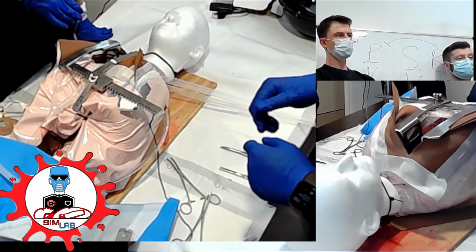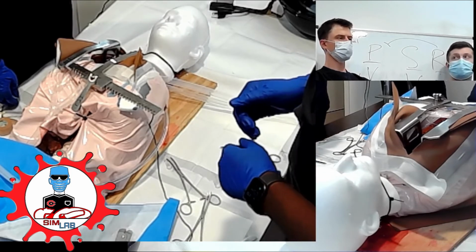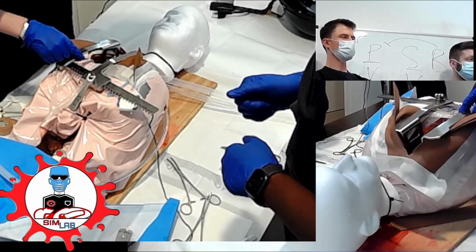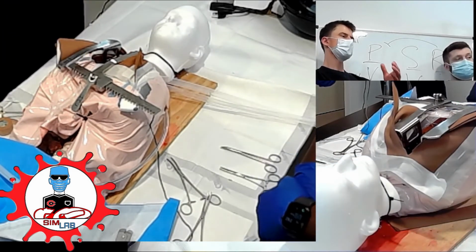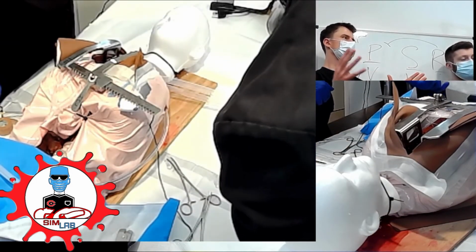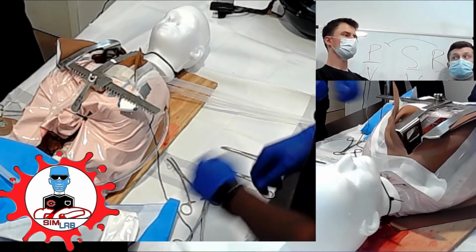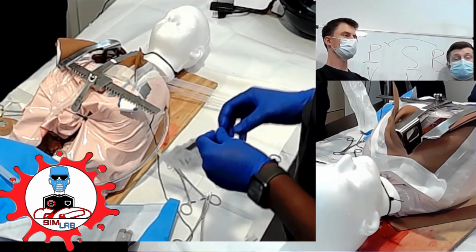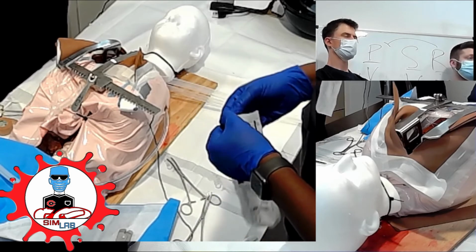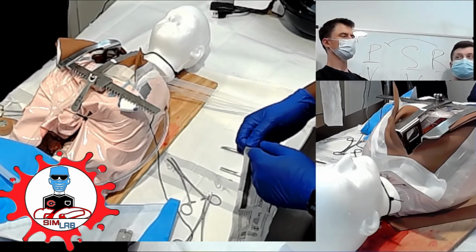But aortic stuff, I got trauma with me, right? Everything else, you can probably pop open, alleviate a little bit of pressure without fully opening the heart, and probably still be okay. If this is really just tamponade, just opening that sternum, maybe just doing that alleviates it, and then you have a perfusing rhythm back. You pop a couple wires and stick a Yankauer in, suck a little bit out. That's enough to alleviate the pressure oftentimes to reestablish a rhythm, and then they're whisking the patient off to the OR. You don't have to necessarily open it up completely, but for SimLab purposes, you must see the heart.